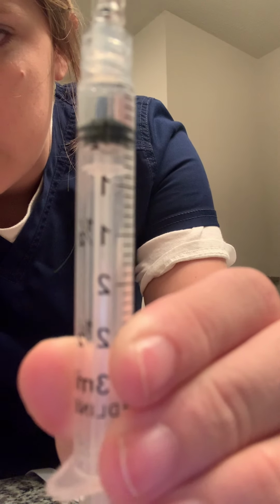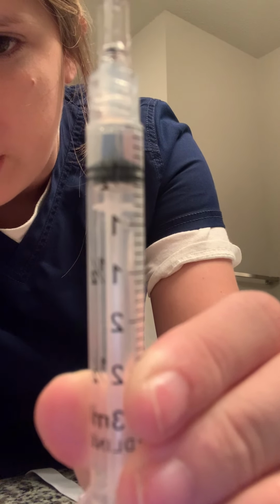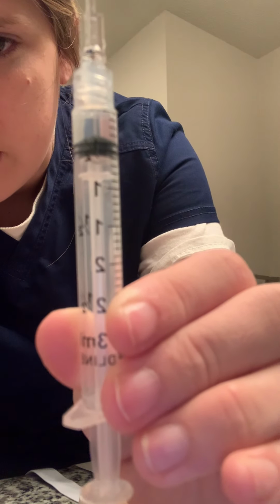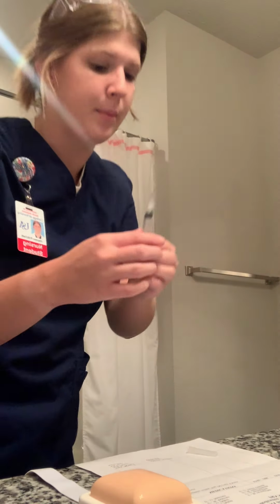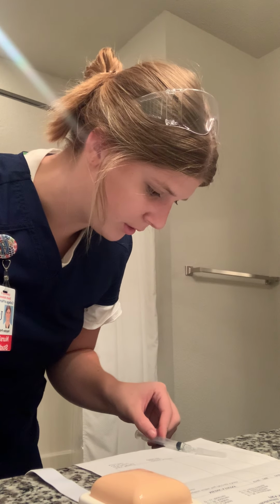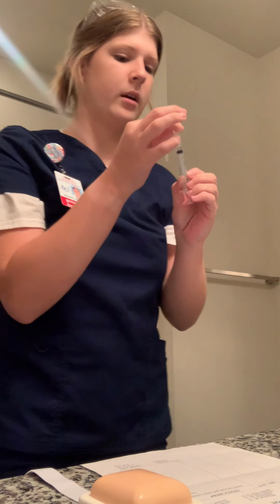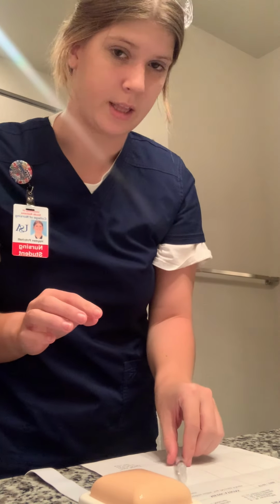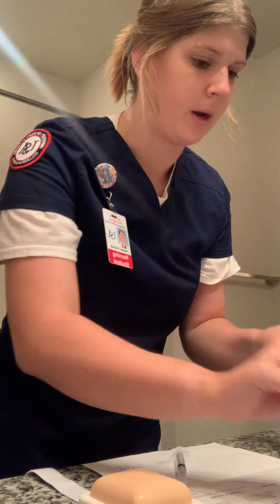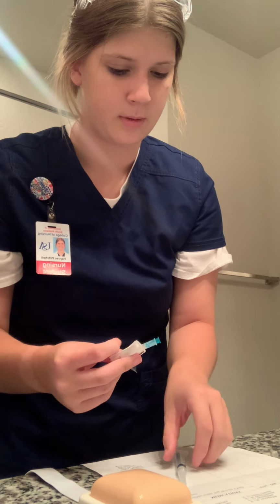It is 1/2 of a milliliter, which is equal to 5 milligrams. Sorry, it's trying to focus. So now I'm going to scoop this back up so I can set that down. And I'm going to grab my 23 gauge needle.